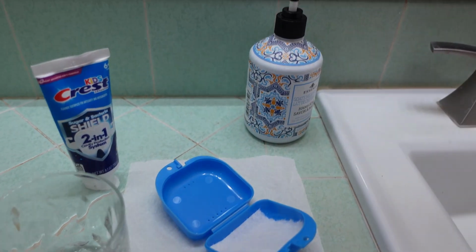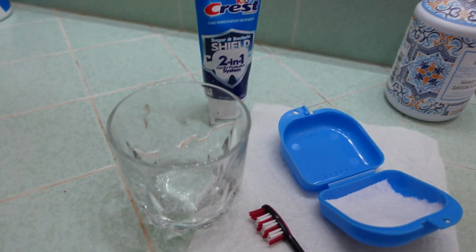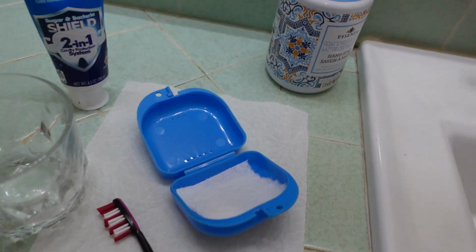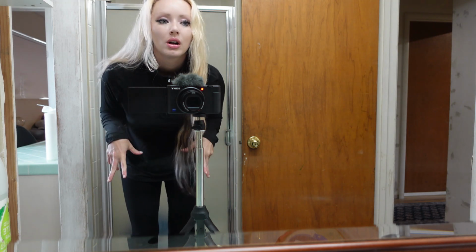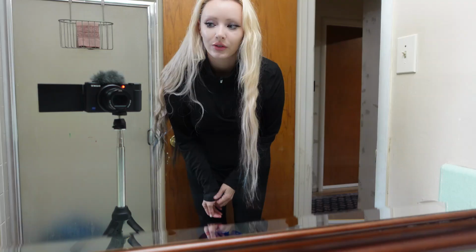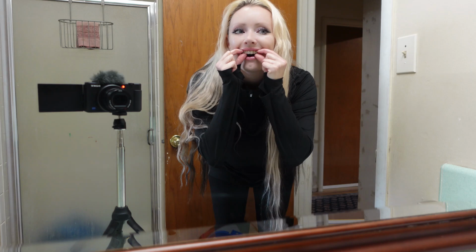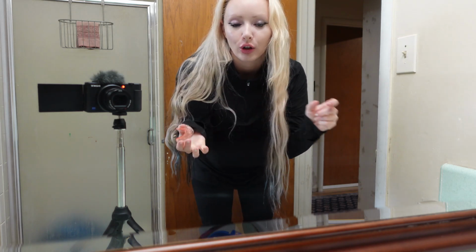Right here you can see that I have distilled white vinegar, the cup, some toothpaste, a toothbrush, my thingy. For the sake of the video, I'm going to act like I just woke up, but I woke up a while ago already, because, you know. First thing I would do is pop the retainer out and rinse it off in lukewarm water.